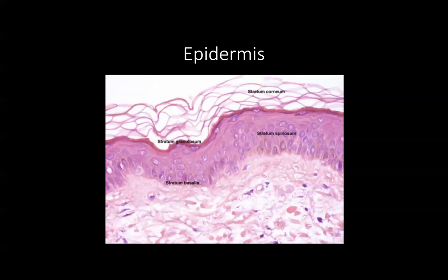Now, you might get hypergranulosis, which could indicate things are happening like lichen simplex chronicus. You can see hypergranulosis, for example. And you may have hypogranulosis, where you can barely see a granular layer or it's completely gone. And that often happens in psoriasis. Just to throw those terms out there for introductory.